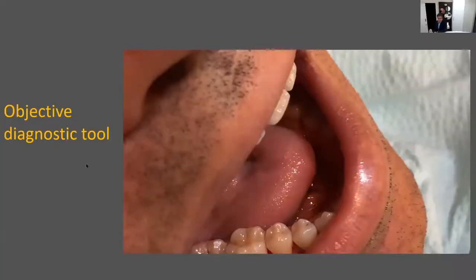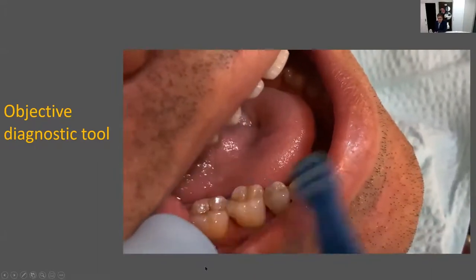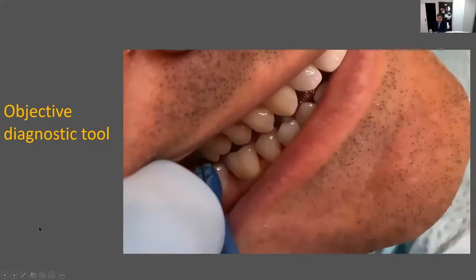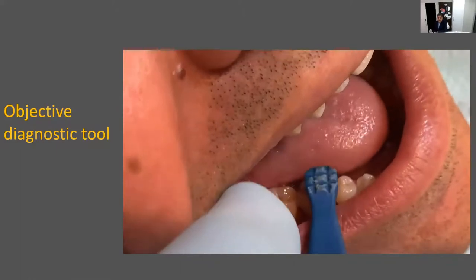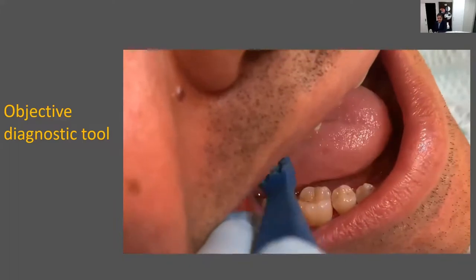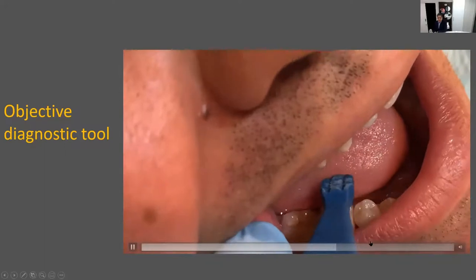Well, when you look at an objective diagnostic tool, you might think you could make the crack worse, but sometimes we need to really test this patient. And as you can see, sorry, I'm going to do a test because I want to take a view. So we're looking at the distal buccal cusp, of the 4-6. So he's got a very stiff cusp. He's got hardly any restorations, right? There's no pain in the mesial buccal. Okay, there's no pain. This is a distal lingual cusp. That's a distal lingual, that's pain. That's a fractured cusp. But have a look at when the pain occurs.